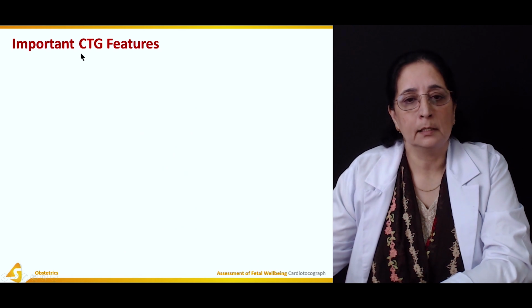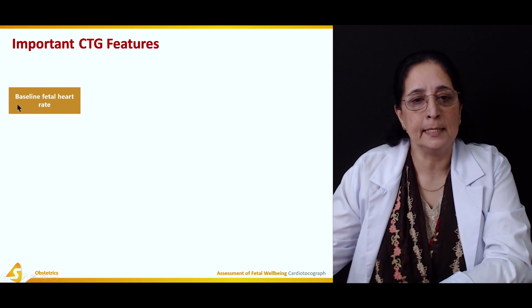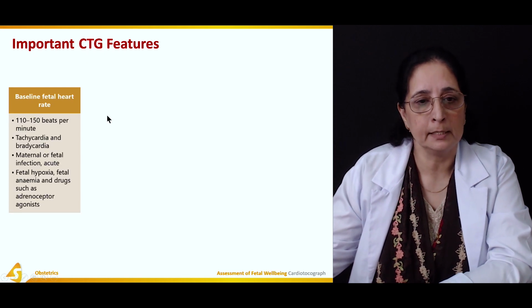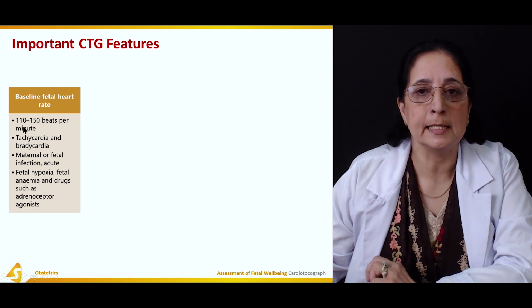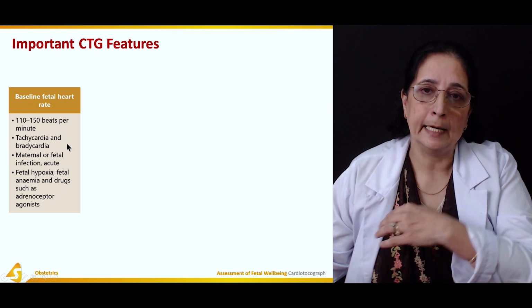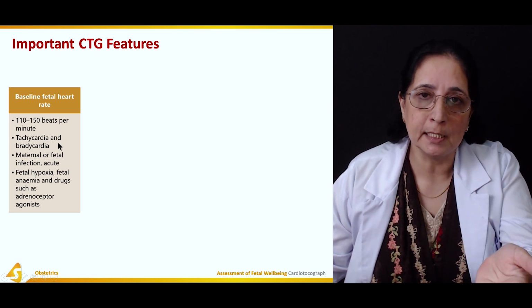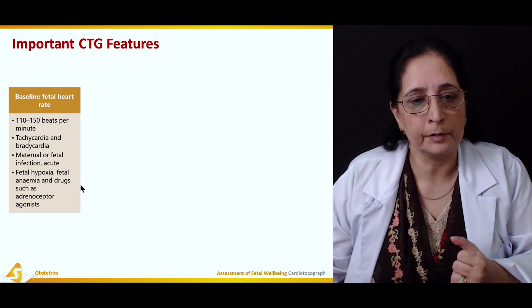Important cardiotocograph features: baseline fetal heart rate. Baseline fetal heart rate is 110 to 150 beats per minute. Tachycardia is increased heart rate. Bradycardia is decreased heart rate.